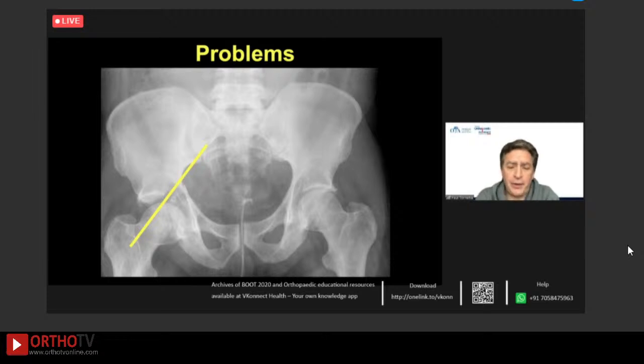That's actually the pattern that Letournel recommended doing, transtectals through an extended approach, which is why I put the flip in there as an option, because he felt it was so important to get the roof of the joint perfect that they did extended iliofemorals for these as a routine. So I've been pretty happy doing them from the front. But my issue is, whenever I try to reduce this over, you're pushing over on the SI joint. So you've got to get the SI joint first.